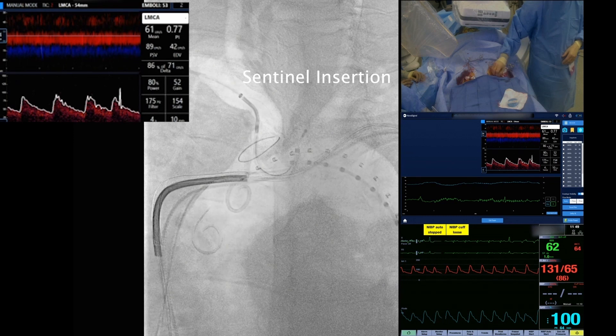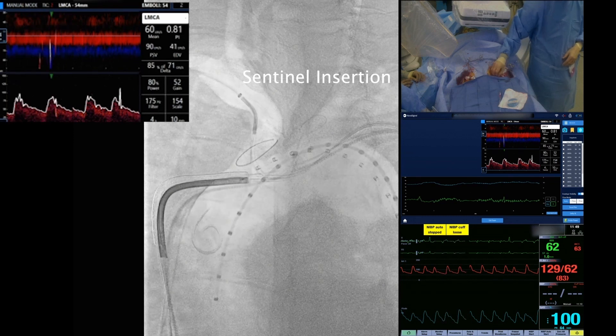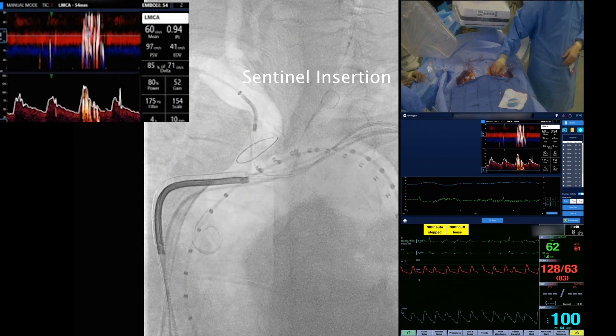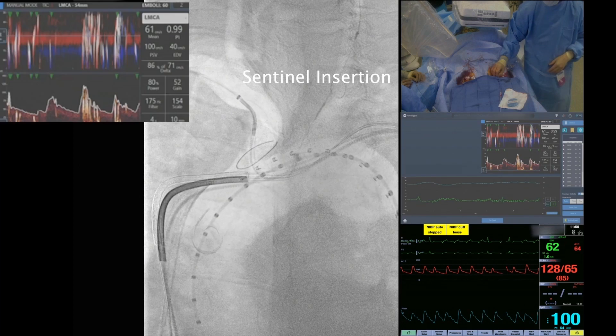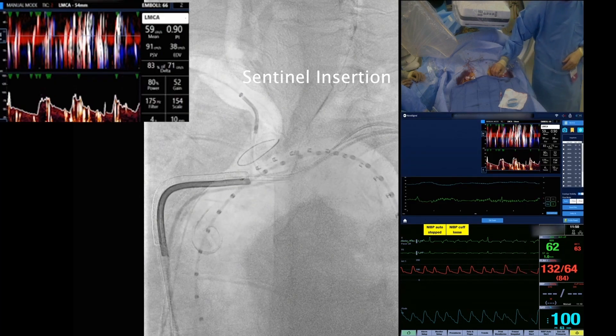The last step is to advance the distal filter and deploy it in the left common carotid artery using the third knob.